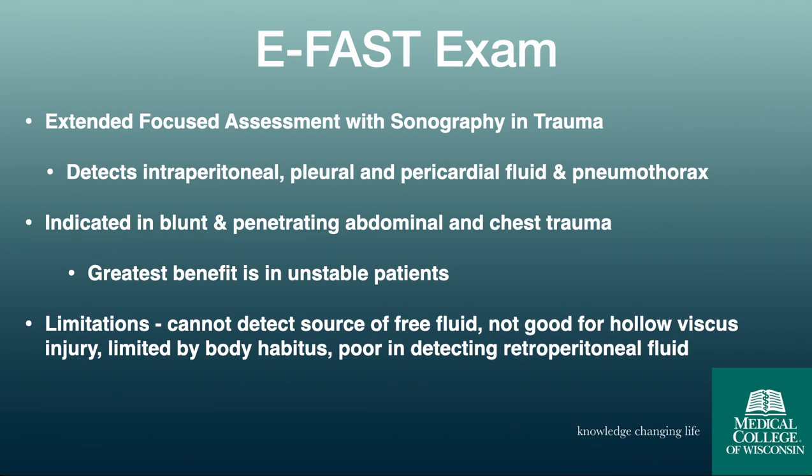And we use this in the setting of trauma. It is best used in our sick patients, and what I mean by that is the data is really positive in that when there's pathology creating hemodynamic compromise like hypotension or maybe hypoxia, ultrasound is likely to pick those up. And so it's indicated in our blunt and penetrating traumas and even chest trauma patients, and again has a great benefit in our unstable patients.